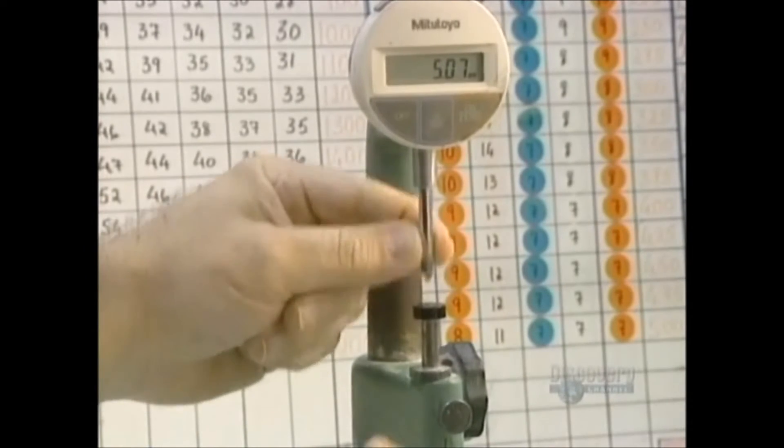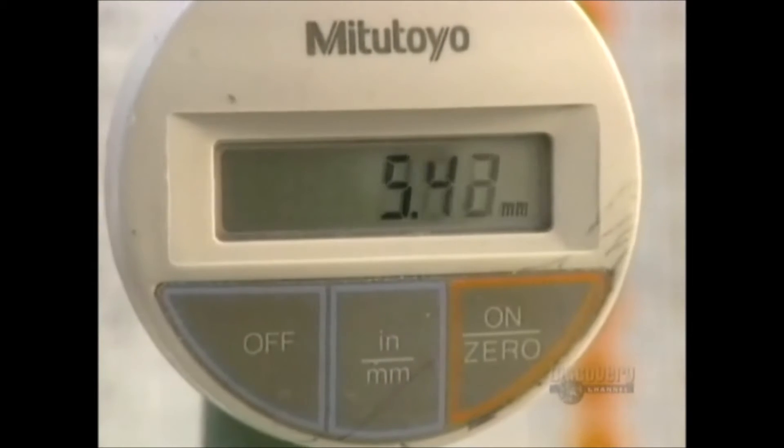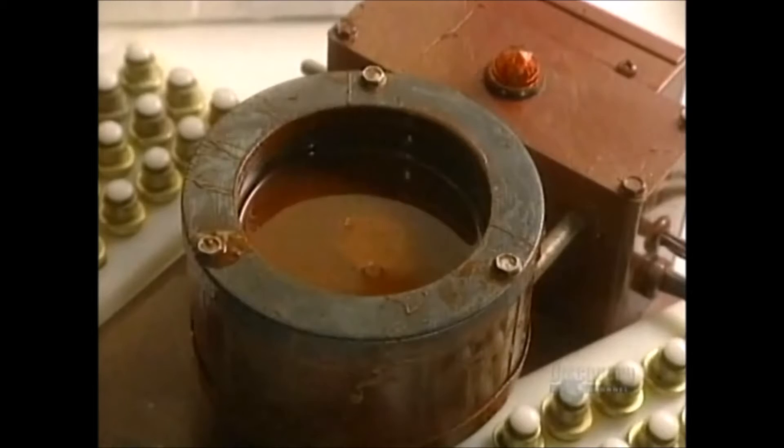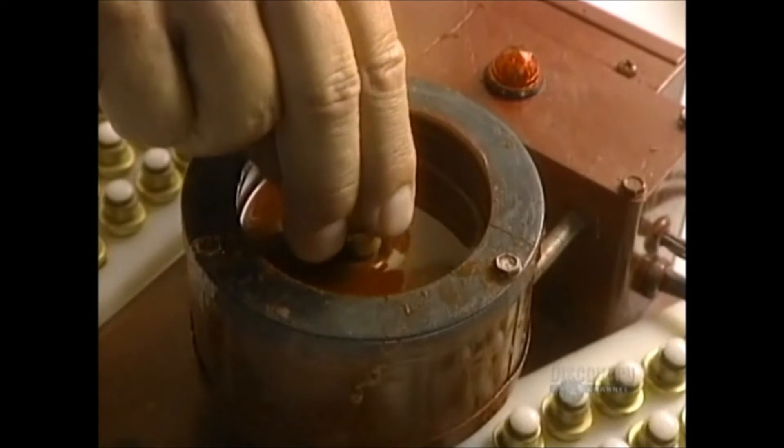A technician measures lens thickness with an extremely precise gauge. They now shape the outer surface, the part which touches the eyelid.